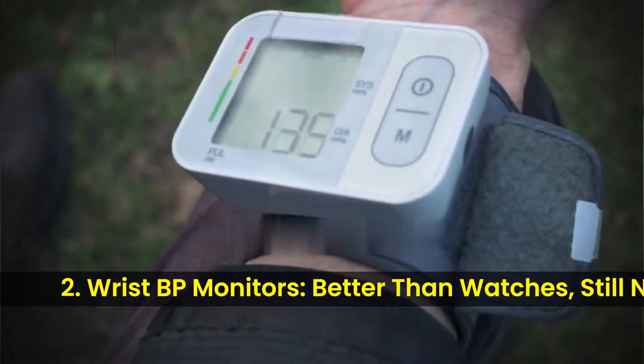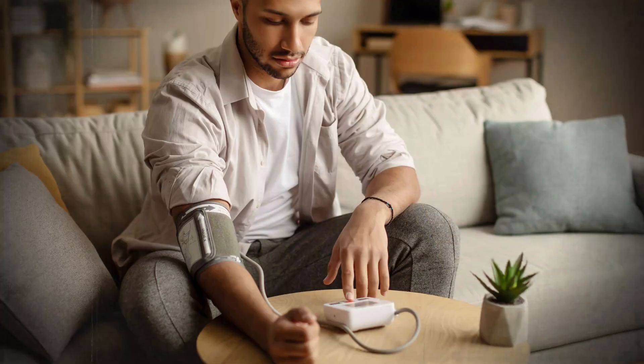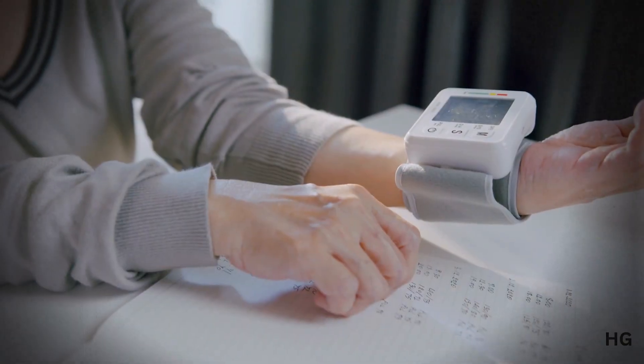Second are your wrist BP monitors. They are better than the smartwatches, but still less reliable than the upper arm ones. Why? Because your wrist arteries are narrower and closer to the surface, so even a slight change in position can throw the reading off.